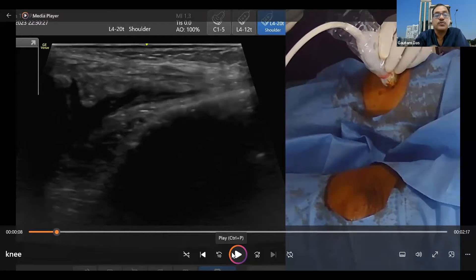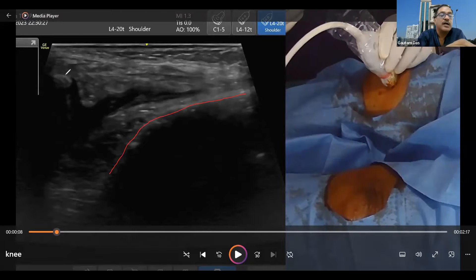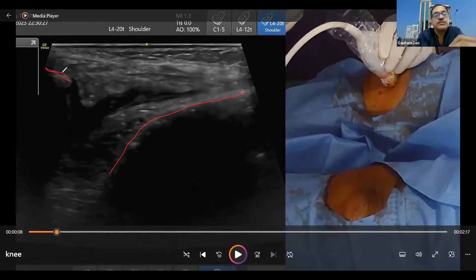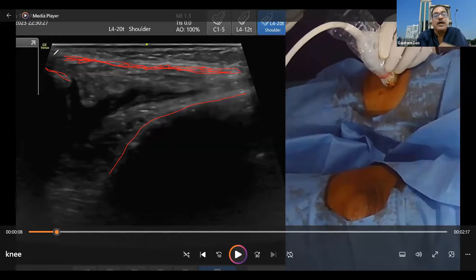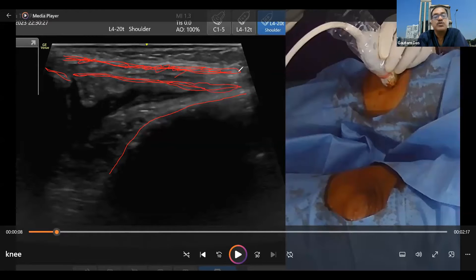Look at the structures we can see here. This is the medial femoral condyle. This is the patella. And here we can see two important structures. One is the superficial one — this is your patellar reticulum. And below that there is another layer, which is your patellofemoral ligament. That is the deeper one. The superficial one is continuous with the vastus medialis muscle.